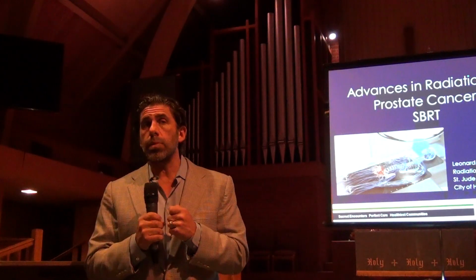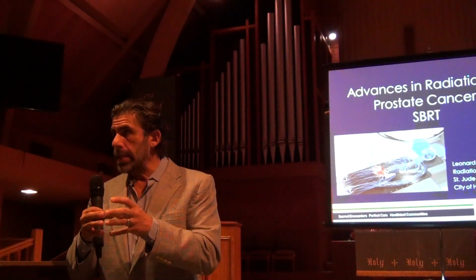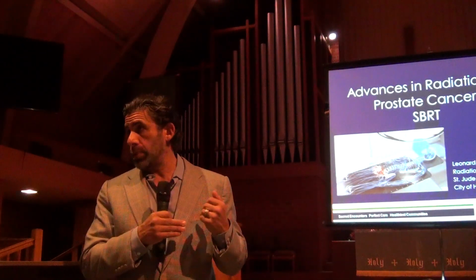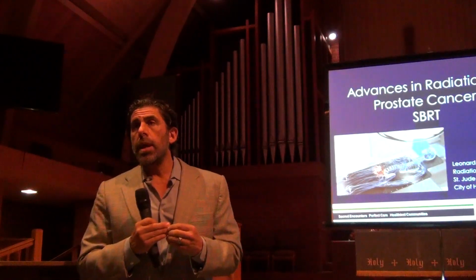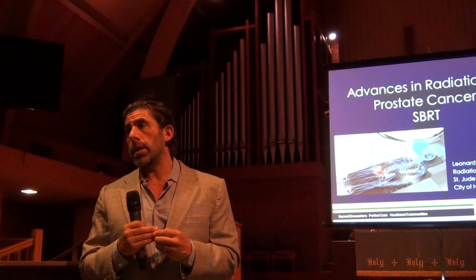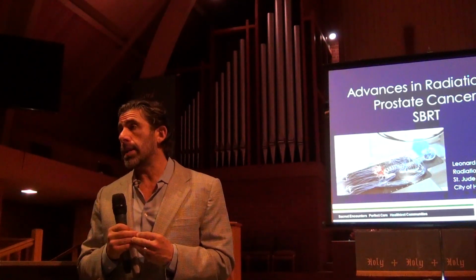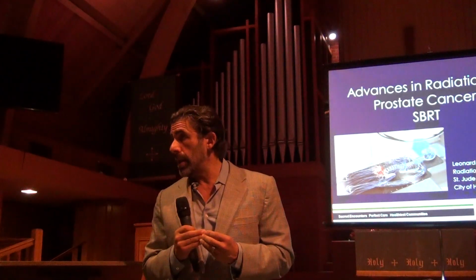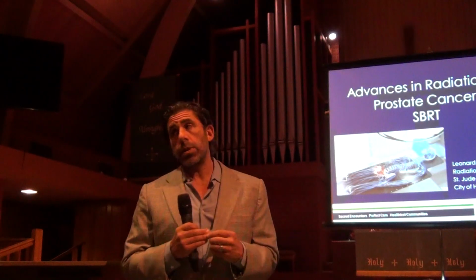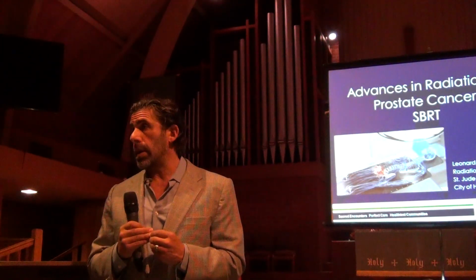The way the dosing works with CyberKnife is you're giving a high prescription point, so the prostate itself was actually getting a higher dose than what's presented there. He has since gone to 40 gray as well, because the numbers really weren't as high as we'd like to see. But it really depends on the patient. A lot of it is the technique. Chris King at UCLA, who I also formulated my program off of, does 8 gray times 5. Memorial Sloan Kettering is at 8 gray times 5.